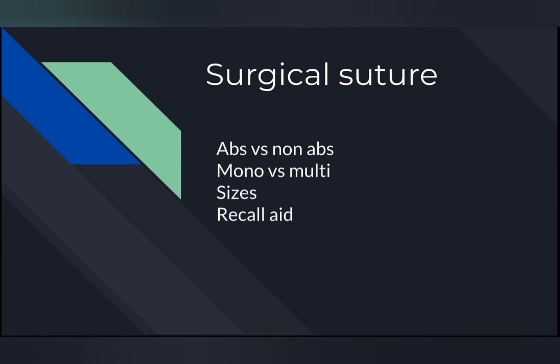So you don't need to go through the process of removing it. And this is best done when the target is on the inside of the body, because you avoid another surgery. So the point to remember here is that absorbable goes away on its own, so it is used preferably on the inside, while on the outside you use non-absorbable suture materials.